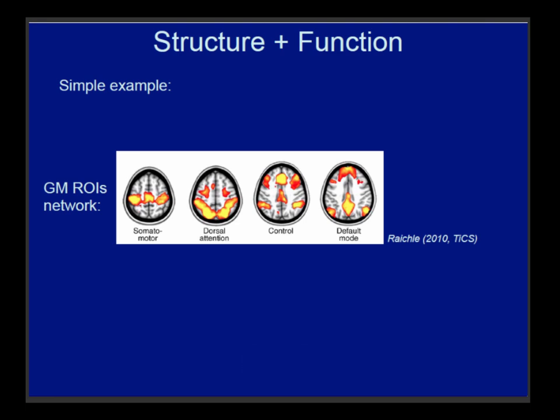Okay, so just as a motivating example, let's say someone gave you a functional study and said, okay, these parts of the brain are working together functionally. Great. What can we do to look at their complementary structural properties? Because somehow they must be communicating with each other, and they're not going to all be connected with each other. There may be hubs or other things, but some of them may be. So what we'd be interested in is finding bridges among pairs of them if we can. And again, not everything will be connected to everything. We wouldn't expect it to be, but there may be some.